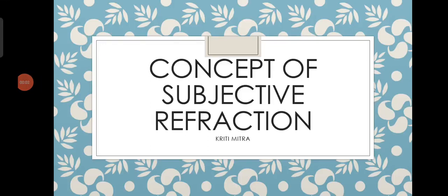Hello, today I'll be discussing subjective refraction. All of you know that we do retinoscopy, that is objective refraction. Now, before prescribing glasses, we need to do a proper subjective refraction. So the concept of subjective refraction is very important to know. You need to know how to do a proper subjective refraction, then only you can exactly prescribe the proper correction to the patient.